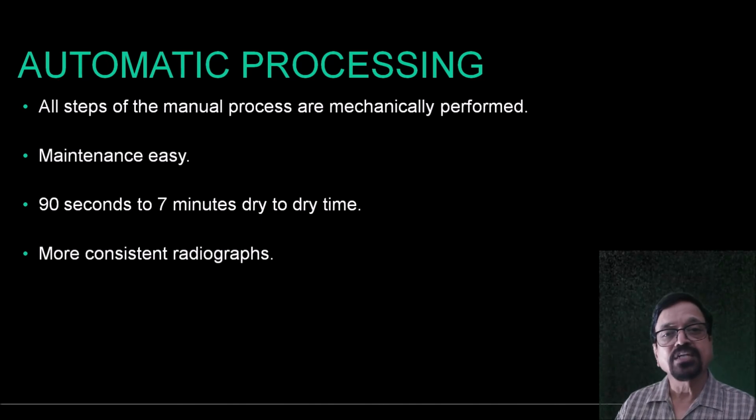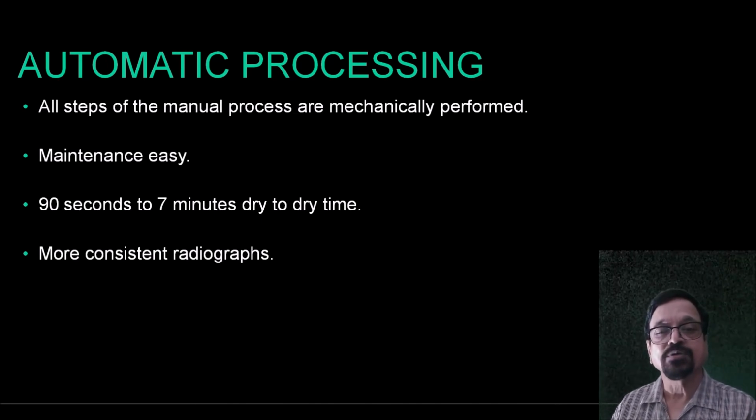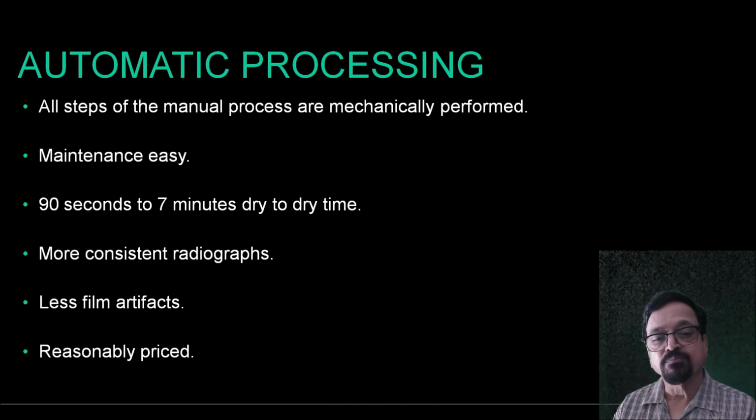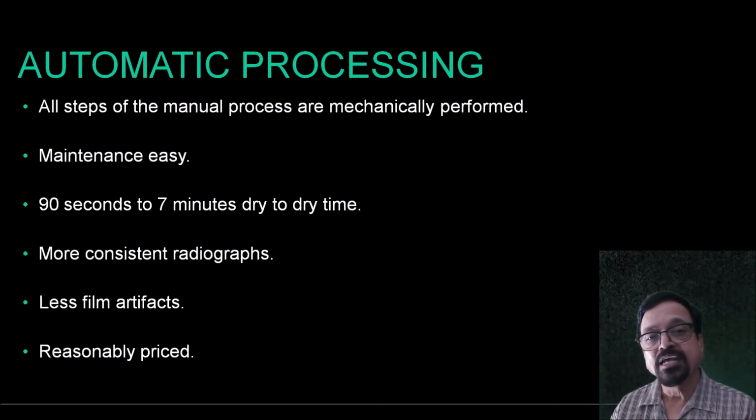The radiographs are of consistent quality because the chemicals are recycled and rotated in more proper ways, and there are less artifacts because the process is properly monitored, properly timed, and there is rinsing and cleaning of the film done in more meticulous ways by the rollers.